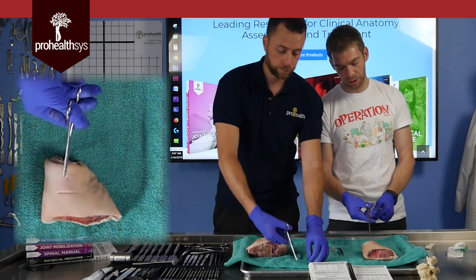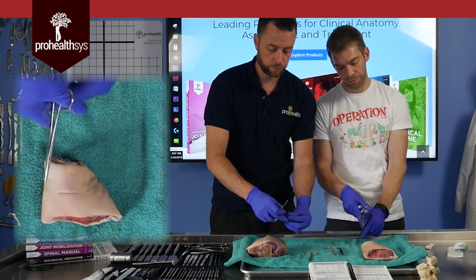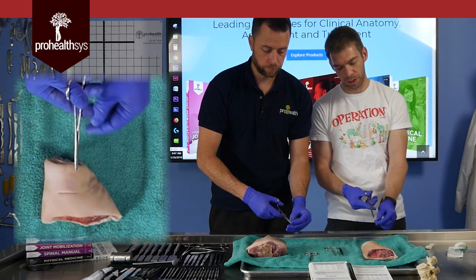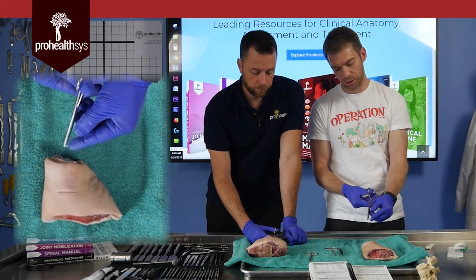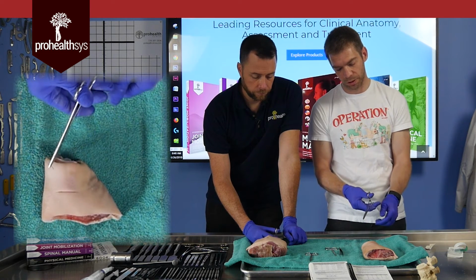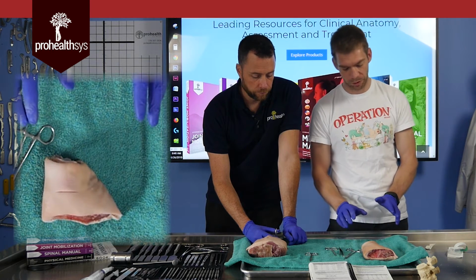You'll note that I'm not right at the back end of the metal. If I'm at the back end of the metal, even as I turn this needle, it'll want to bend where I'm grabbing it. So I want to adjust it a bit more. It's almost like you've got 60% of the metal on the cutting side of the suture and 40% on the back side. I'm going to lock it, and then I know where it is, and I feel safe.